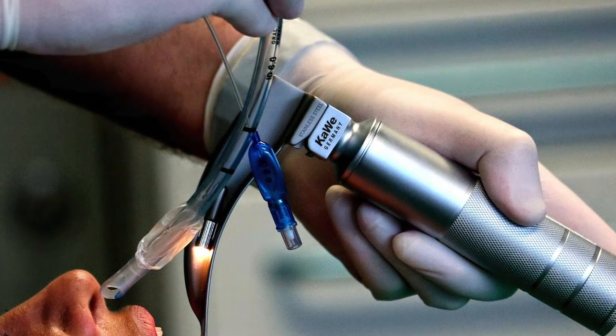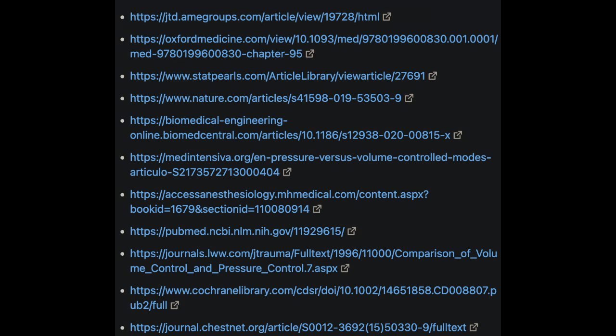The most important discovery of the respiratory system dynamics equation is that any ventilator we can imagine is capable of controlling only one variable at a time during inspiration, pressure, volume, or flow control, but not two variables at the same time. In the new generation of ventilators, the doctor can also set the rise time, that is, the time required to reach the set pressure.